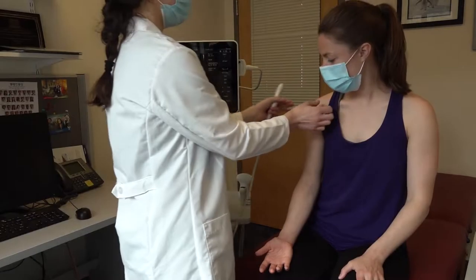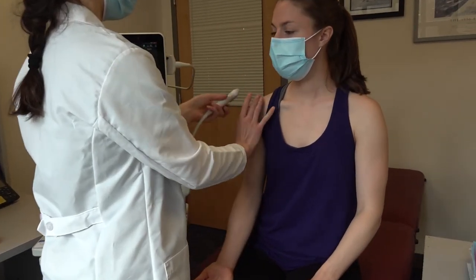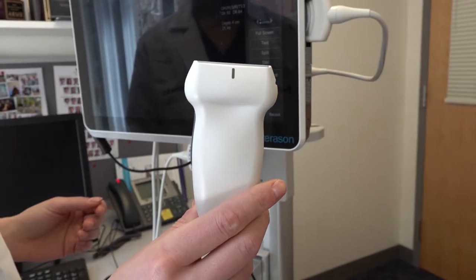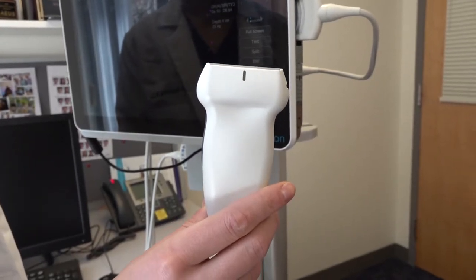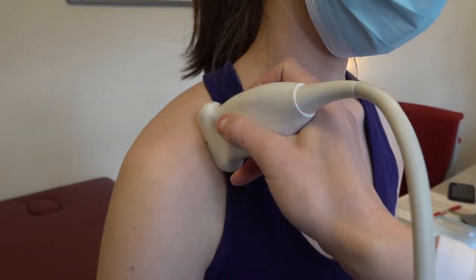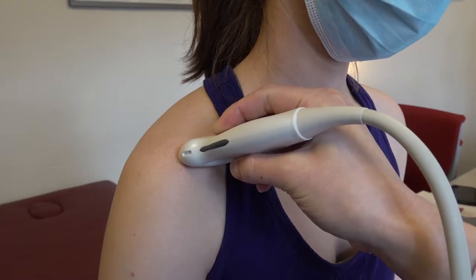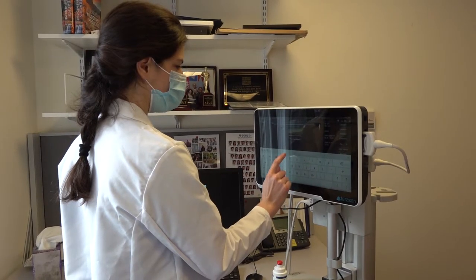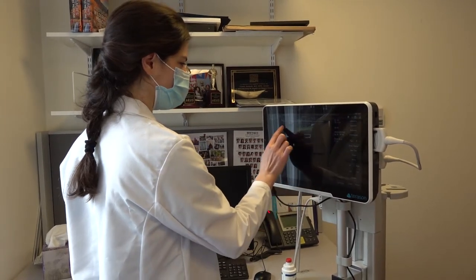In this video, we will provide stepwise instruction for performing an ultrasound examination of the shoulder. For this protocol, we will be using a high-frequency linear probe. The probe marker should be oriented cephalad or toward the patient's right throughout the protocol. As some conventions call for medial probe marker orientation, we suggest labeling images for clarity.